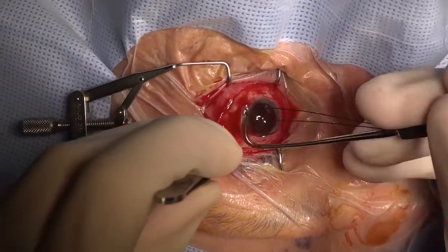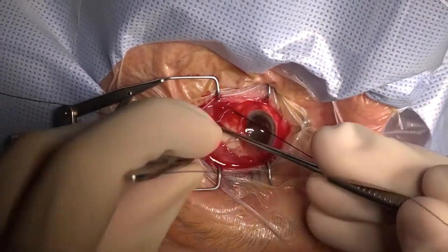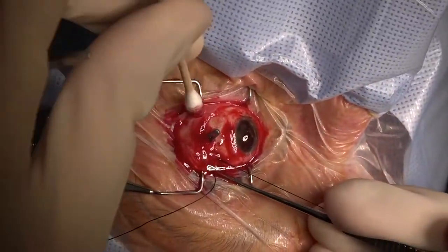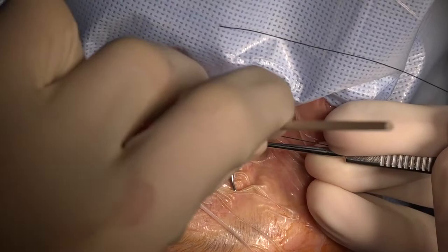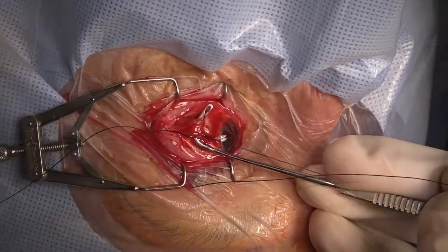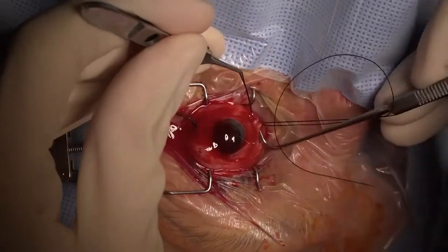Next, we're going to isolate all four rectus muscles and place a 4-0 silk suture around each muscle. It's important when doing this procedure to dissect back the tenons and make sure that the entire muscle has been looped rather than splitting the muscle.